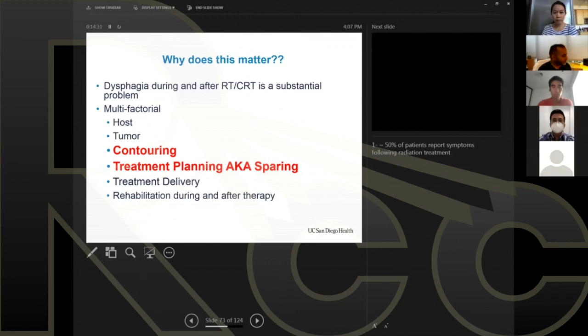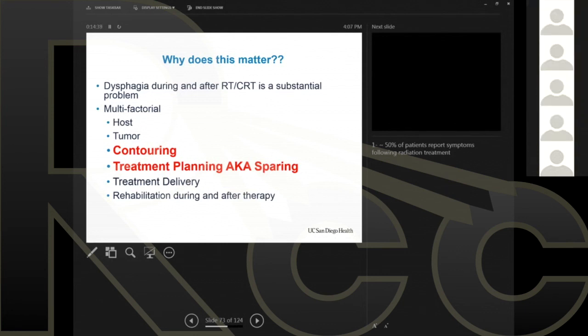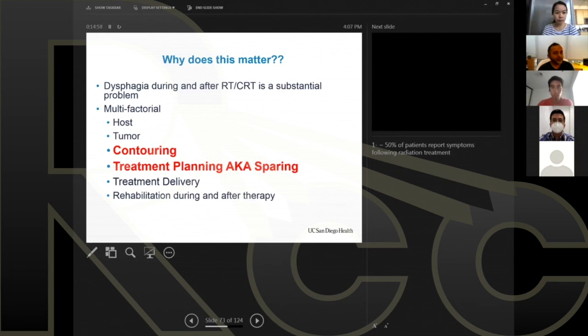And now there is a surging interest in adaptive radiotherapy. I think most of us, at many institutions, including I'm sure yours, if you see a drastic reduction in the patient's tumor volume and/or weight, have the opportunity to re-simulate, re-contour and replan during treatment. With a new platform coming out, one of the new Varian machines called Ethos, there will be the ability to do continuous adaptive radiotherapy where you will be able to replan on the fly every day right before you deliver the treatment. So instead of having one or two plans over the course of 7 weeks, you will have the ability to conform your contours and your plans to the anatomy of the day and deliver a new radiation treatment plan daily. So that really is the next frontier coming in terms of treatment delivery.